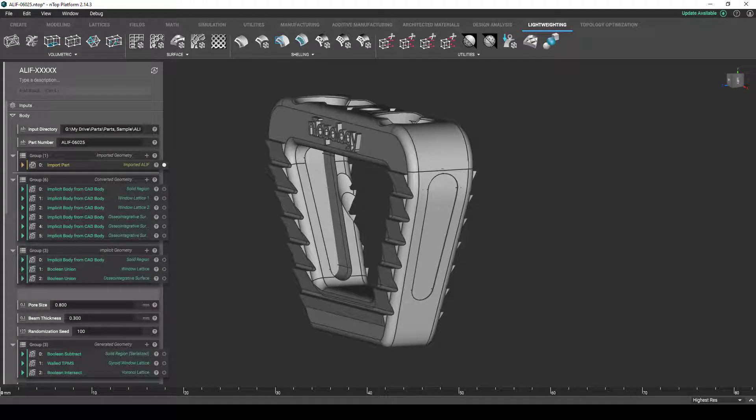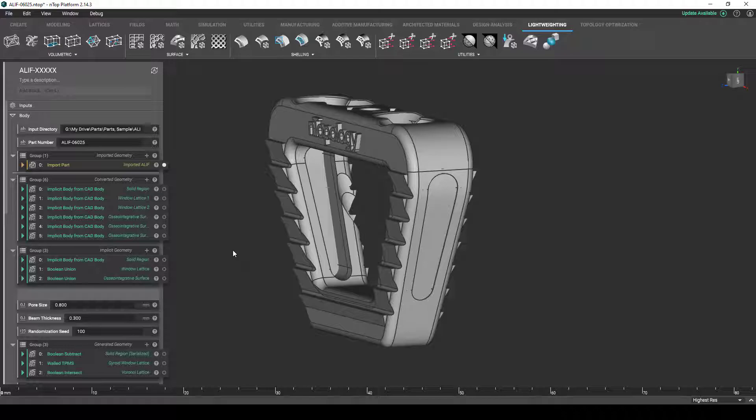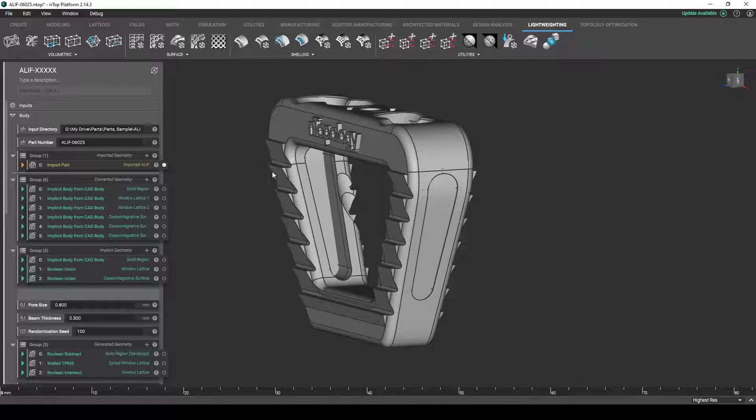So, pulling up our actual workflow, we're going to see the design workflow that we described in actual practice with this ALIF. Called out at the top of this is the input directory with a reference to the part number. By changing just this part number, the entire workflow will actually import a new part configuration and update to accommodate the new geometry.